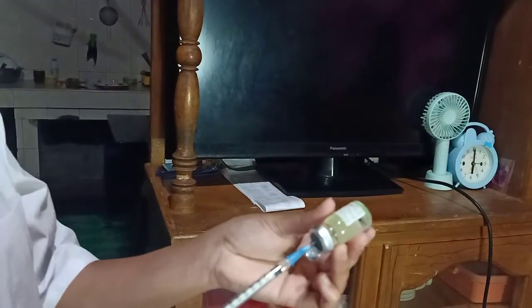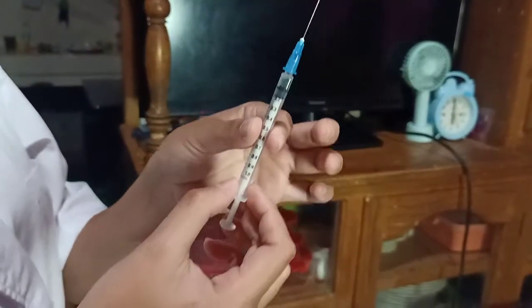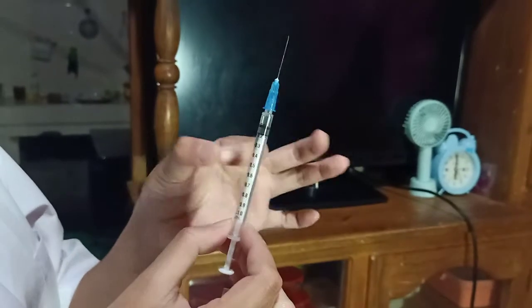Now, if there is any bubble trapped inside the syringe, tap the barrel.